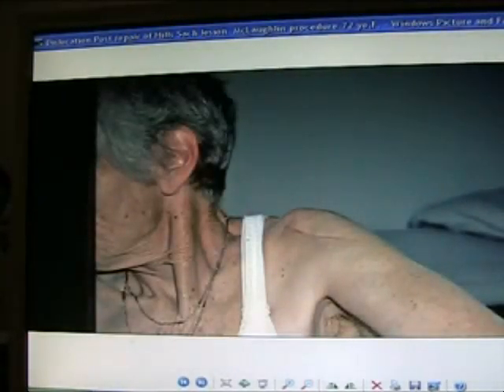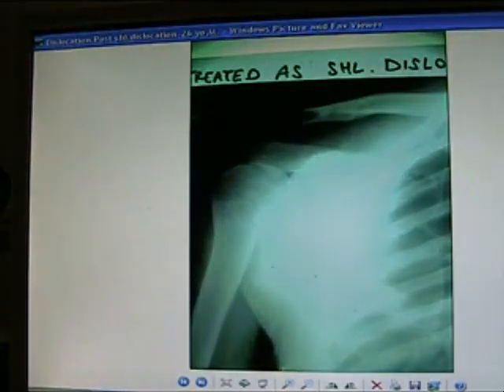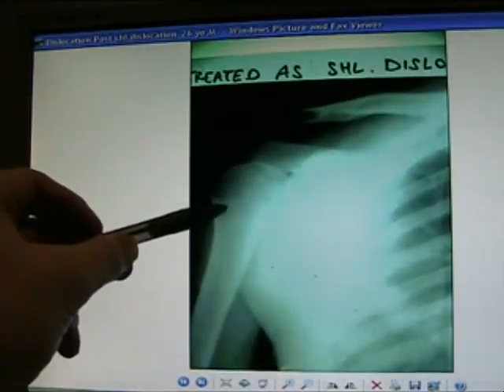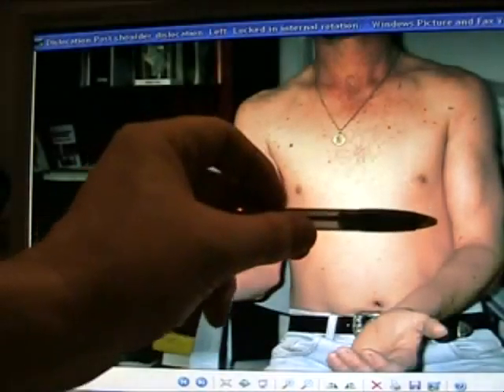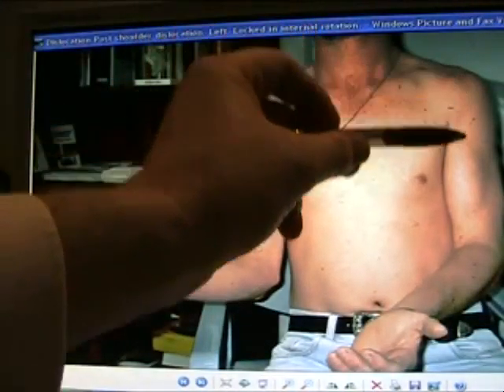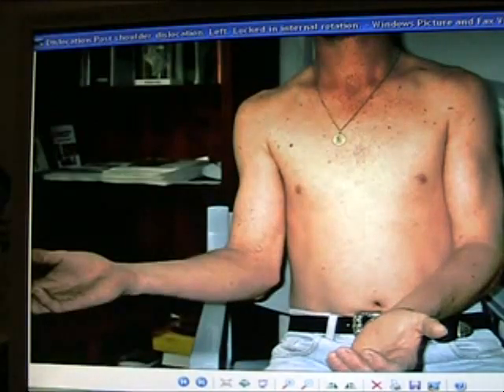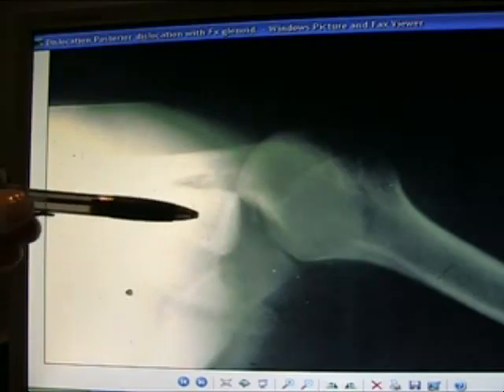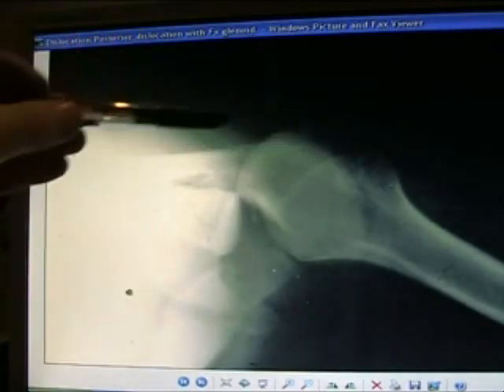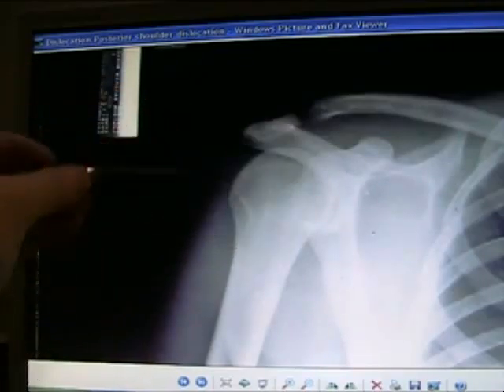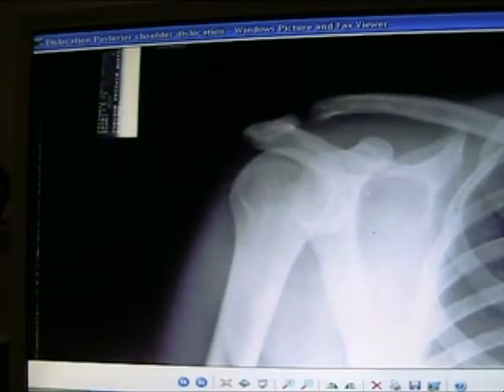Post repair of a Hill-Sachs lesion. Posterior shoulder dislocation — don't miss it. Symmetrical appearance of the humeral head. Typical posterior shoulder dislocation, locked in internal rotation — don't miss it. There's a posterior shoulder dislocation out the back. The symmetrical or ice cream cone appearance of the humerus.